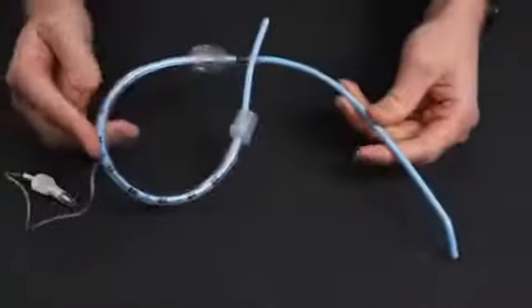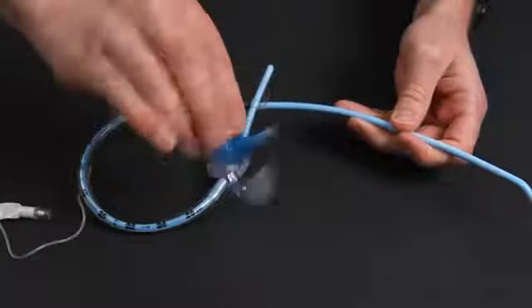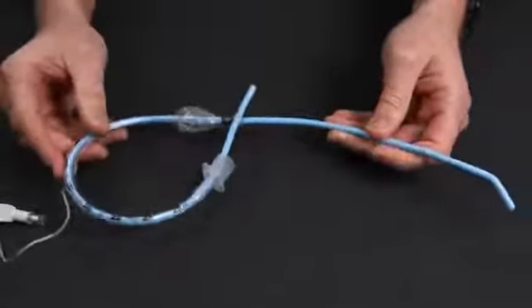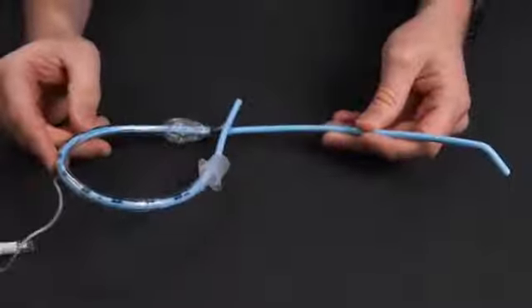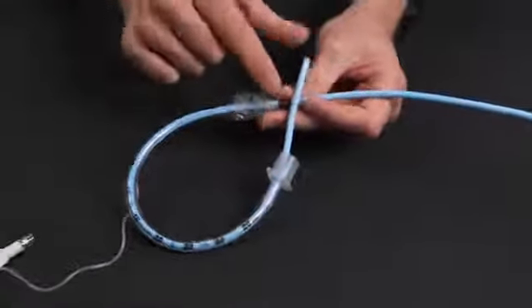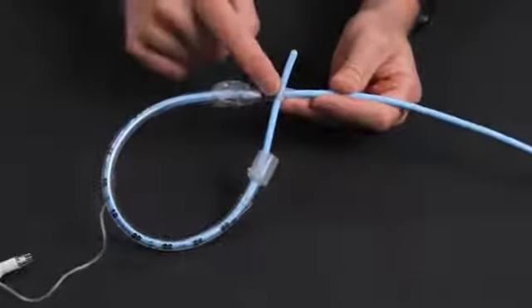So if you are using an endotracheal tube and you do not have a cric-specific tube to use, there's a couple tips that I think will make this a little bit easier for you. Number one, I like preloading the tube onto the bougie. So here I've got the tube over the bougie, and then I actually have the tip of the bougie going into the eyelet at the bottom of the tube.